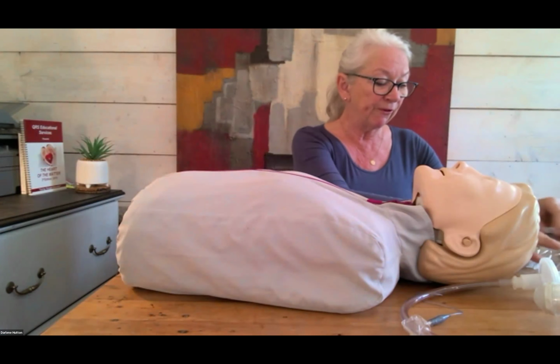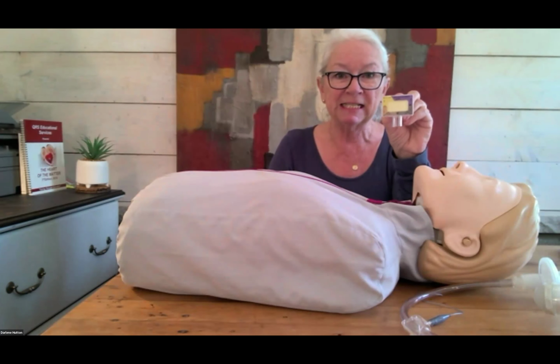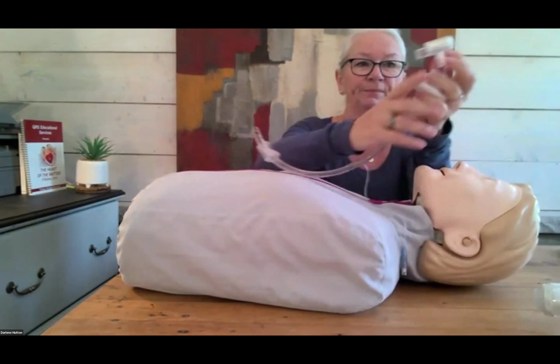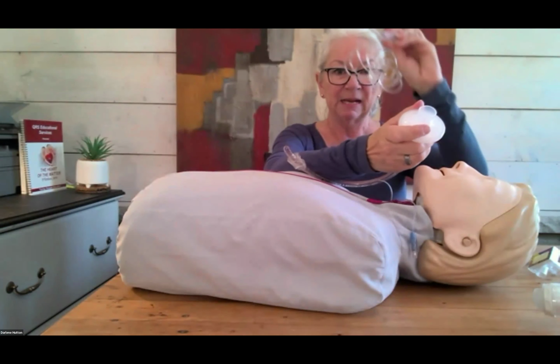And so for that, what you're going to have to do at some point is you're going to have your proper monitor. You're going to take this off of the endotracheal tube. And you are going to insert this type of device.